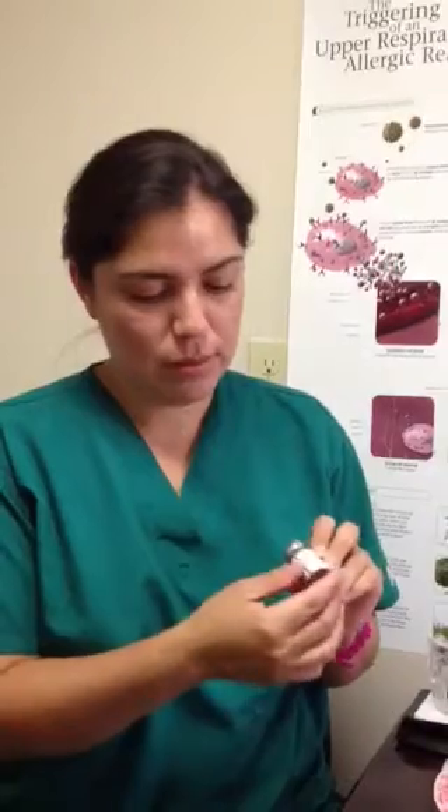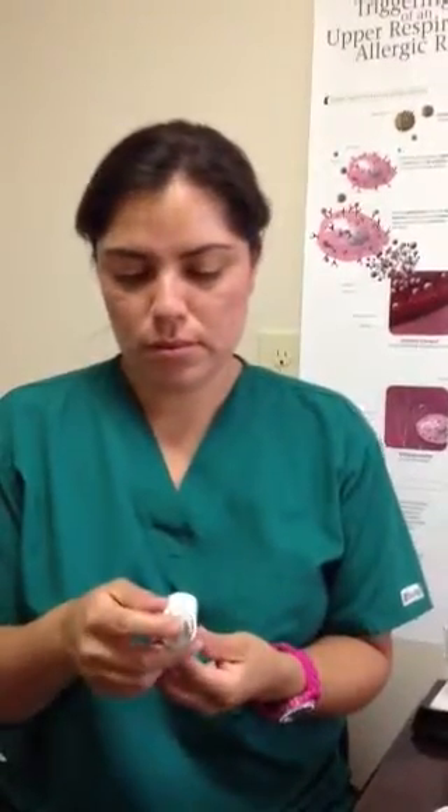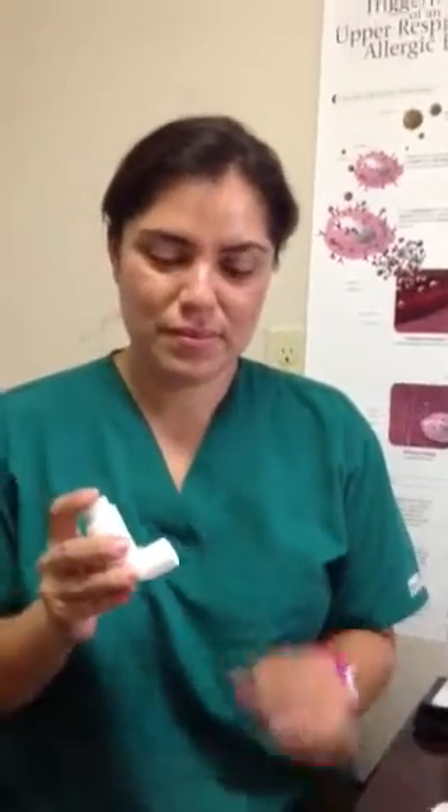I'm going to walk her through it. So the first step always — 5% of patients forget to do this one thing — is checking the expiration, looking at the counter to make sure you have enough puffs left. Most of the new inhalers now have counters on the back. 5% of patients forget to take the cap off. She's going to make sure she takes the cap off.